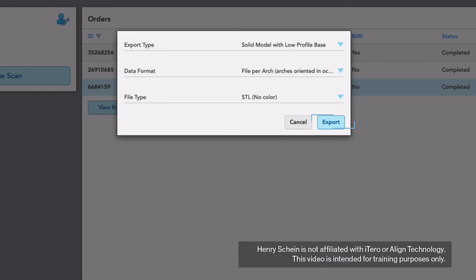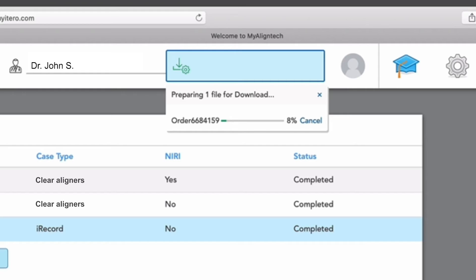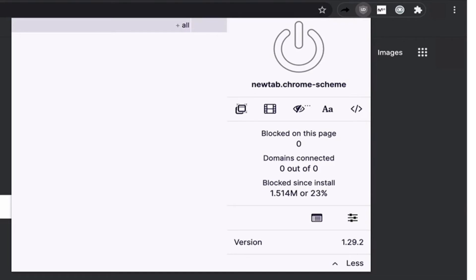Click Export. STL files are large and may take a couple of minutes to download. If there is a longer delay in exporting a file, ensure any pop-up blockers are turned off.